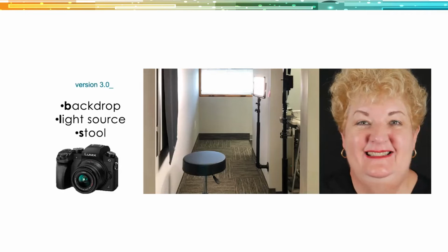And for these portraits, we're actually using a Panasonic Lumix. It's a mirrorless camera, and we're shooting on the auto setting. And so there's not a lot of training that you need to accomplish to be able to outsource this to one of your team members. And you can take pictures like I just did on the right side of the screen. That's my dental assistant, Robin. And we can get pretty nicely exposed photographs with the proper amount of clarity and resolution to be able to load these pictures into the Smile Design software.